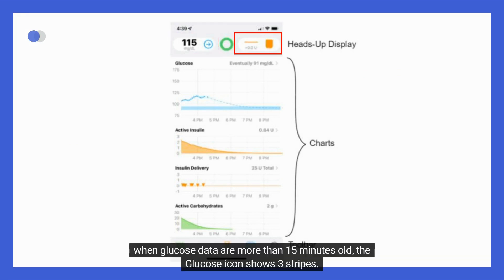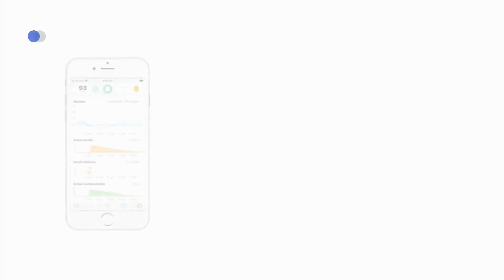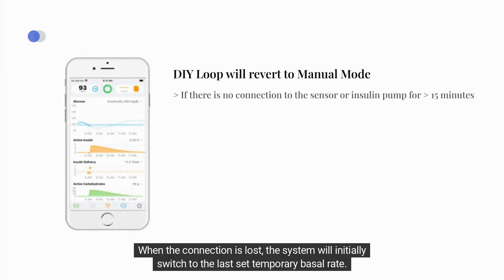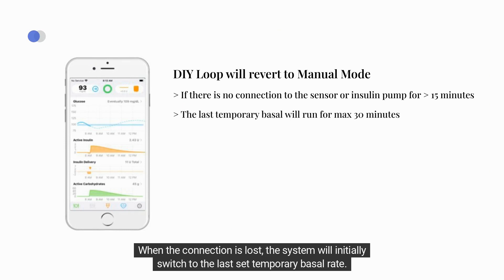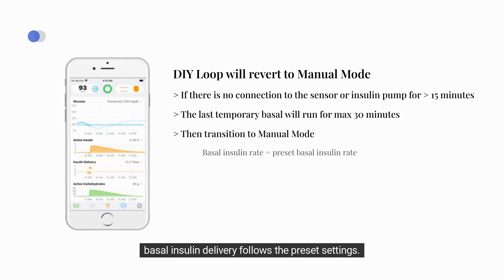For example, when glucose data are more than 15 minutes old, the glucose icon shows three stripes. And when the pump is having a communication issue, you will see a no signal icon. When the connection is lost, the system will initially switch to the last set temporary basal rate. After a maximum of 30 minutes without a connection, DIY Loop will transition to manual mode, where the basal insulin delivery follows the preset settings.